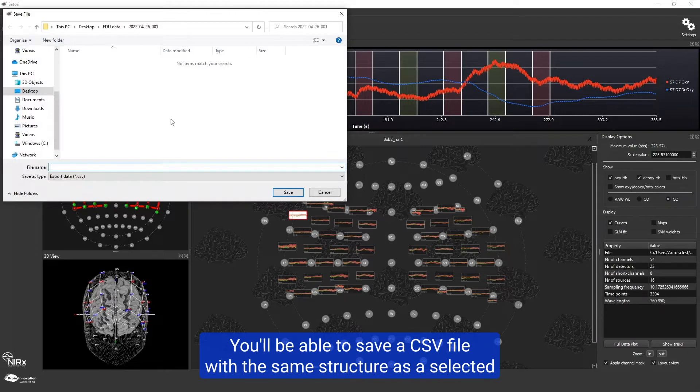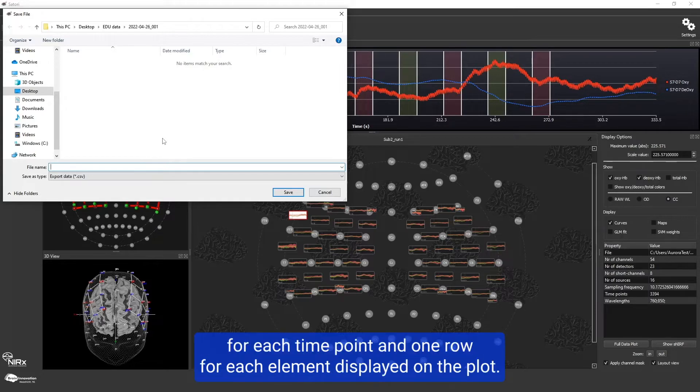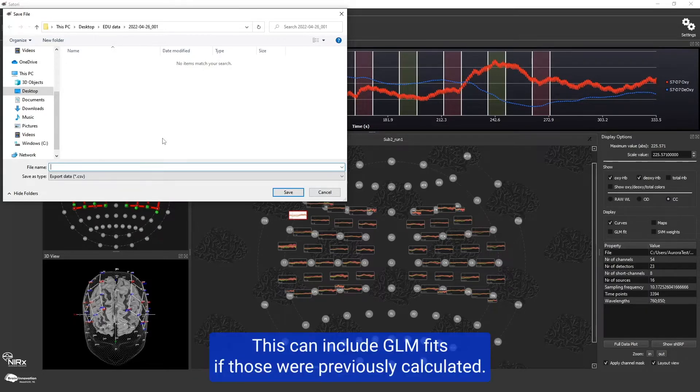You will be able to save a CSV file with the same structure as a selected channel plot, with one column for each time point and one row for each element displayed on the plot. This can include GLM fits if those were previously calculated.